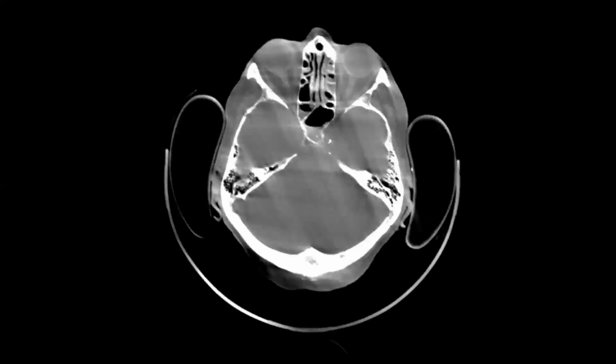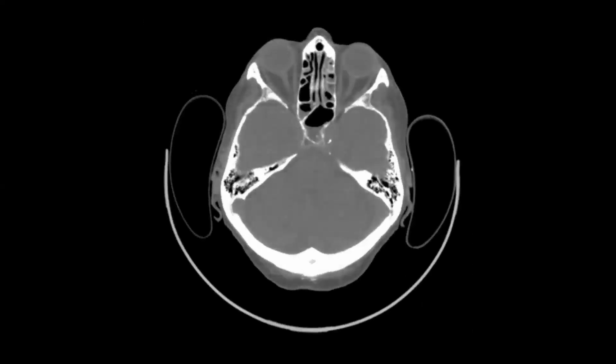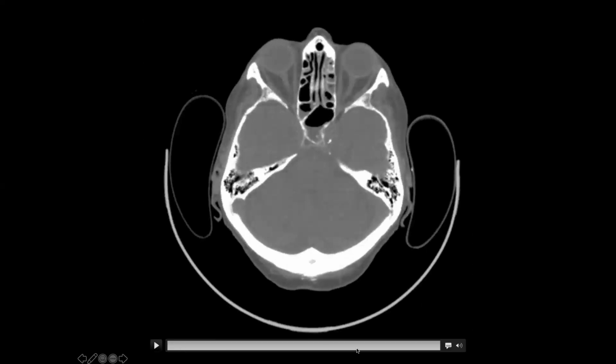You can see how the object kind of emerges as you add more projections into it, right? If we go back here, here's one projection, a group of projections that are close together in theta, adding more projections. You can see we've kind of reconstructed a lot of good edges in this direction, perpendicular to this line. We have all of these edges nicely reconstructed, but edges in this direction we have no idea about, because all of our projections thus far have come from this direction, right? So as we add in those projections, we will see more edges in that object.